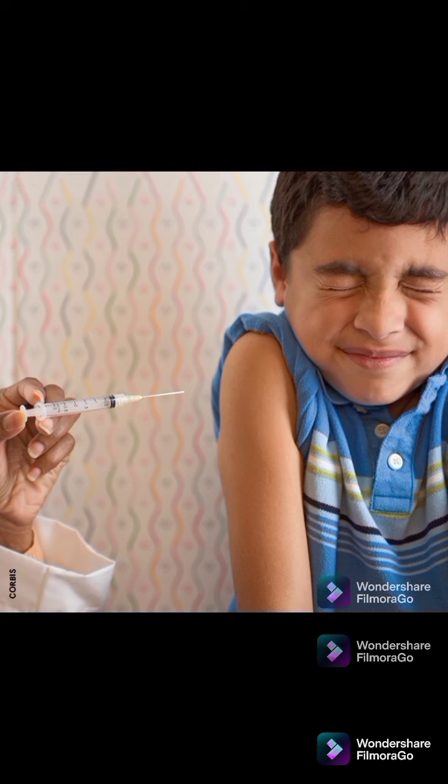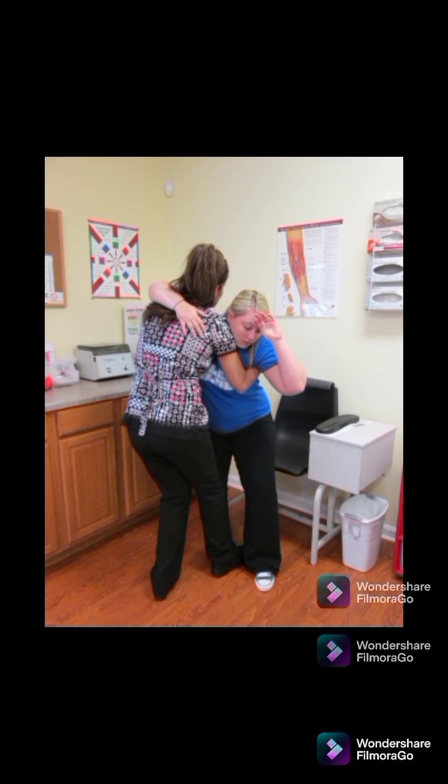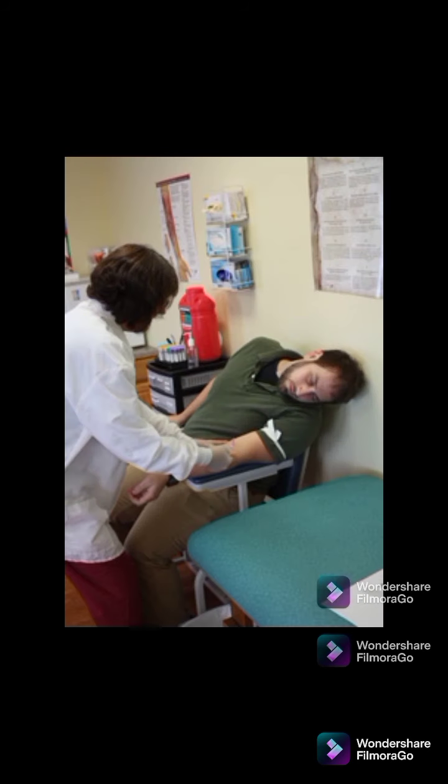Should a patient faint during blood collection, release tourniquet, remove and discard needle as quickly as possible, apply pressure to the site, lower the patient's head and have them breathe deeply. Apply a cold compress or wet washcloth to the forehead or back of the neck. Call for first aid personnel if patient is unresponsive, and document the incident according to your facility's protocol.